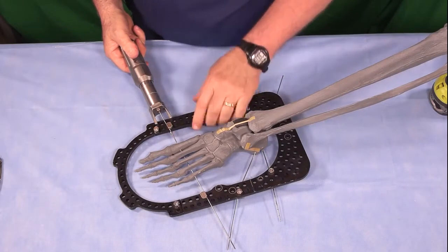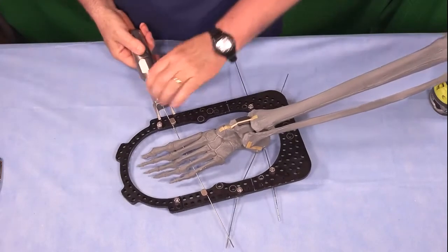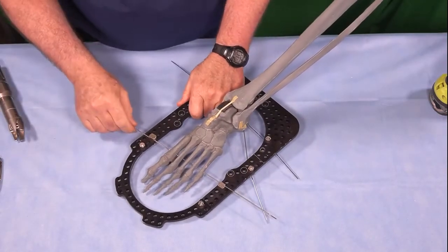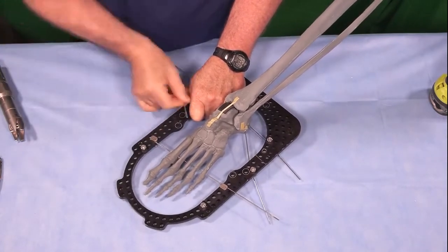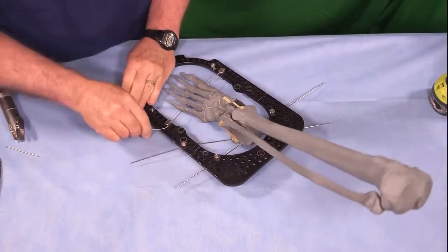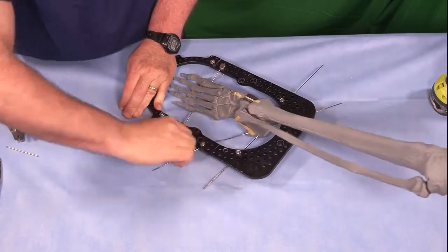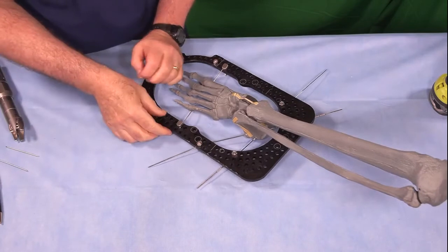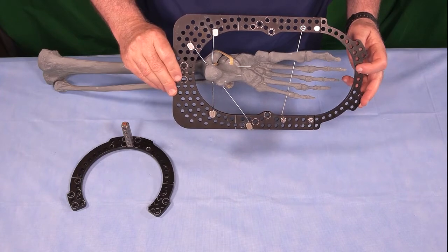I'm tensioning the last of these 3 wires. And to create more safety in the operating room, I'm going to show you a technique for breaking these wires at the base of the wire fixation bolt. If you just bend them parallel to the surface of the ring back and forth 4 or 5 times, the wire will break, and it will break very close to the wire fixation bolt so you don't have to worry about cutting yourself. I've completed the provisional fixation of the foot with the 2 calcaneal wires and the 1 metatarsal wire.